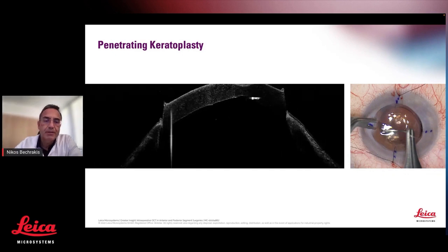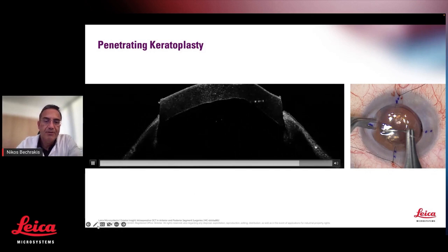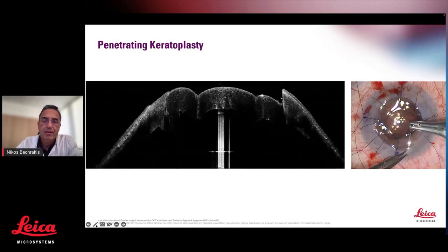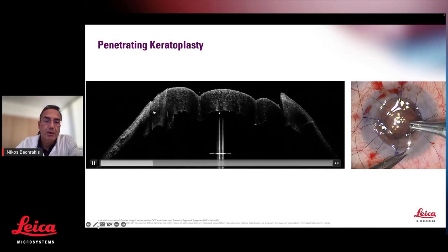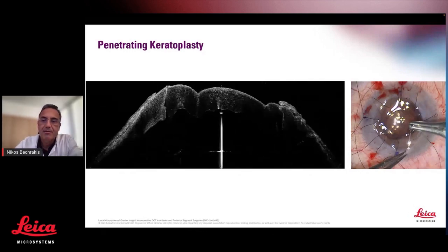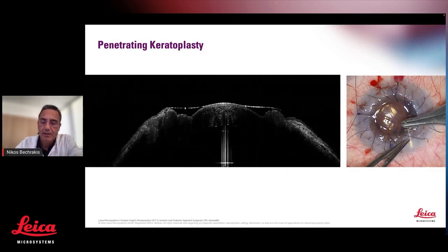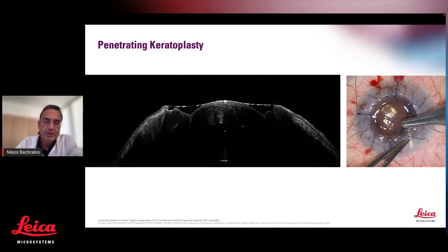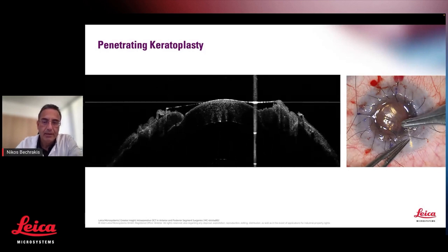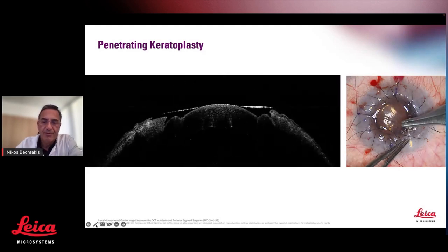Then just by putting the new cornea, you can see the very first adaptation, putting the first sutures, then the running suture. You see how irregular this is. Obviously, no surgeon is satisfied when somebody sees this. This is placing the second suture. And to be honest, I wouldn't realize how irregular the cornea is while doing this procedure, because you're just used to seeing this en face picture.